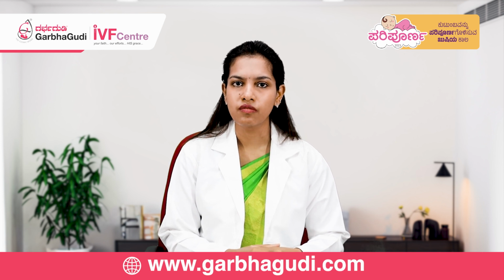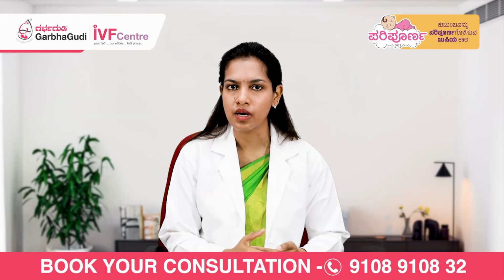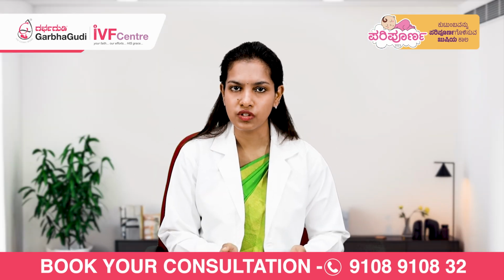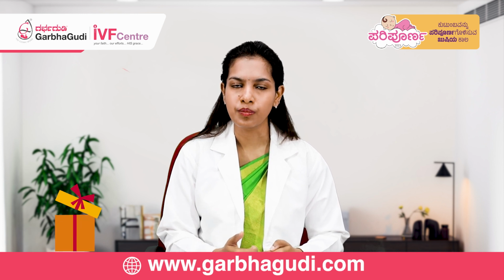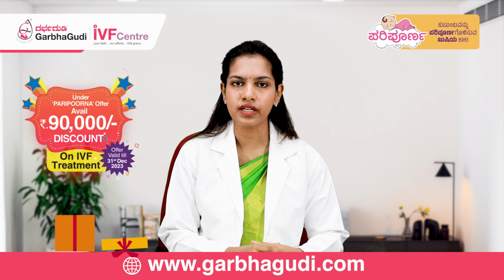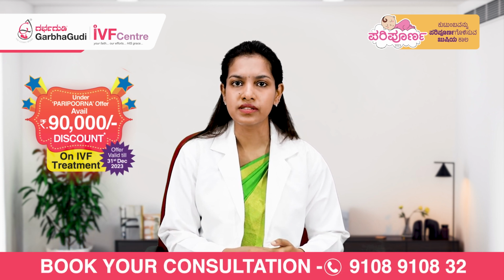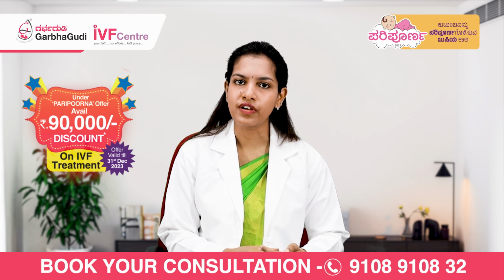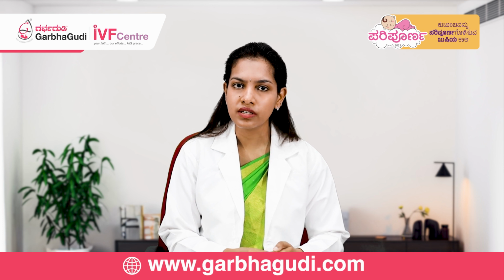Also, when some females undergo hysterolaparoscopy, as in they're undergoing a laparoscopy for some reason, to see the patency of the tubes or for drilling of the ovaries, then we combine it with a hysteroscopy and also have a look at the uterine cavity. In other cases, it helps us diagnose the presence of endometritis, which is an infection of the uterus. Post the treatment of such conditions, the reproductive outcome of these women greatly increases.